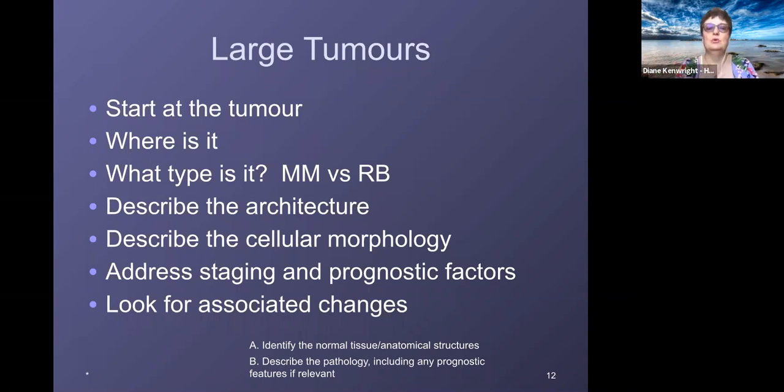This is particularly important in melanoma, because if they stream together, then you know it's probably going to be a spindle B. And if it's a sheet, it could well be an epithelioid. The architecture in retinoblastoma, for example, is often a vessel surrounded by live tumor and then necrosis and calcification. If you go a bit closer, it's got little rosettes. So the architecture is how the cells fit together in their jigsaw.